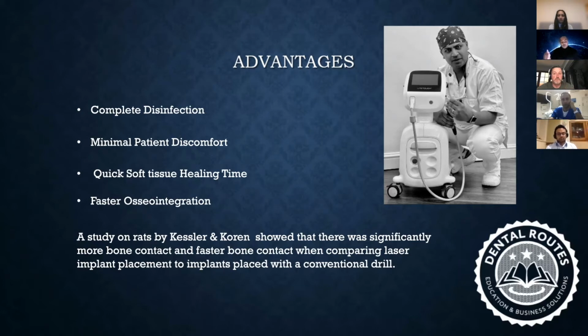The amount of soft tissue healing time is drastically reduced. The amount of inflammation is so minimal that the healing time is very, very minimal post-operative. And the amount of osseointegration with your implant is extremely fast. It's very, very fast. I just quoted one study out here, but there are multiple studies out there which show the rapidity with which osseointegration happens around your implant when you have used laser to enrich the tissue.